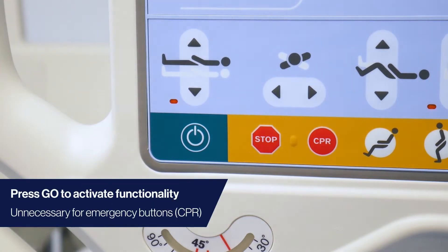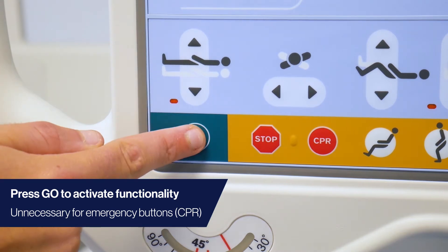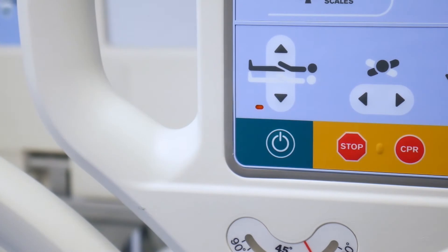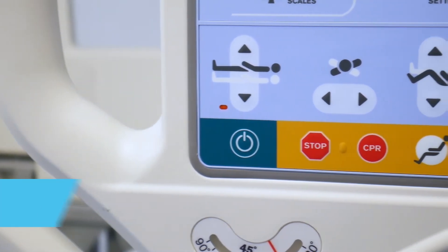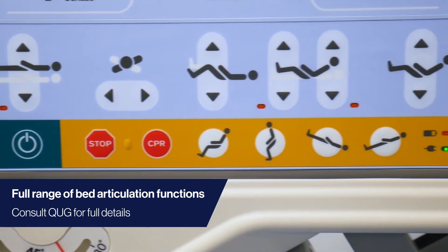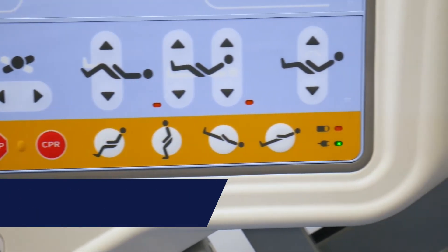Remember to press the go button before pressing any other buttons. This activates the bed's functionality. Here you can find many familiar buttons for standard bed articulation. Please consult the quick user guide for detailed explanation on these functions.